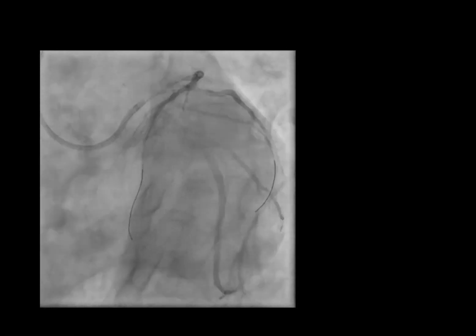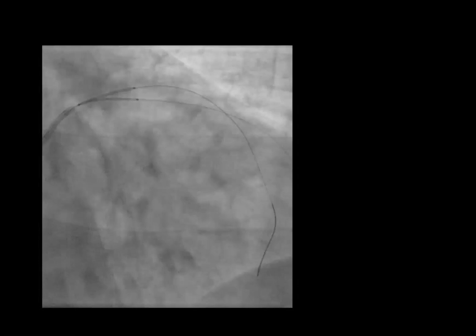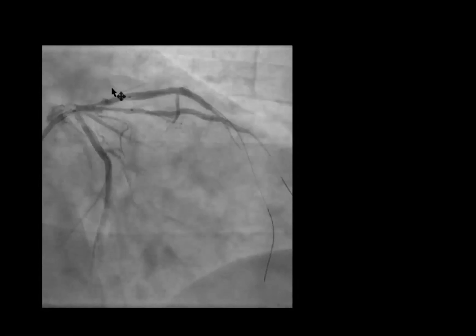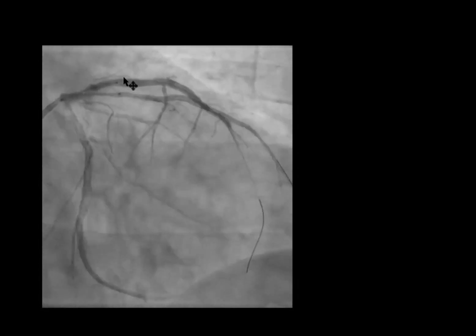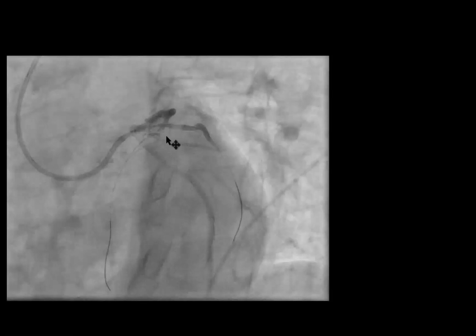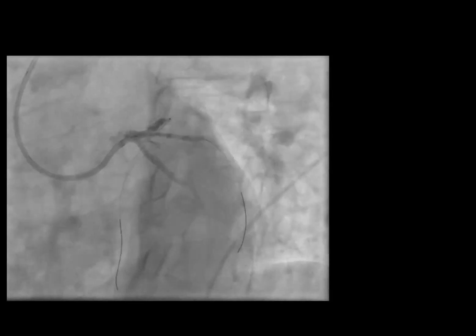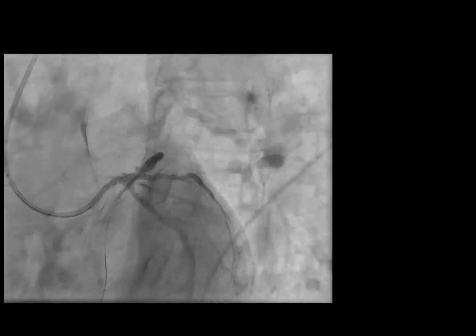At this time, I decided that I should do the mini crush since the patient was in pain. It's difficult to do a mini crush in this patient because of a 6-French guide, but I put in a 2.5 by 20 stent in the diagonal artery and a 3.0 by 20 in the proximal LAD. In mini crush, you go up with the stent in the side branch first. Once that is up, then you take the wire out. Then you go up with the main branch stent.